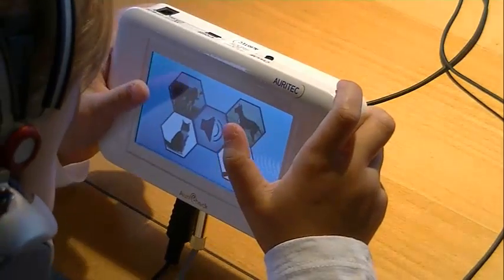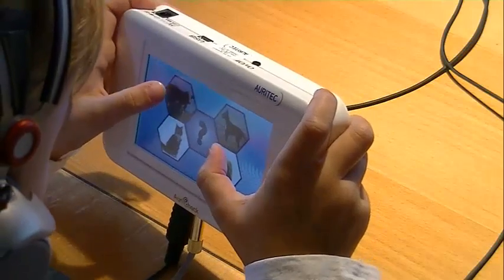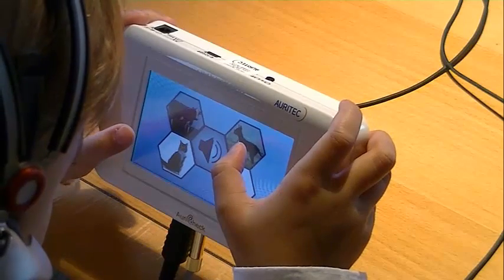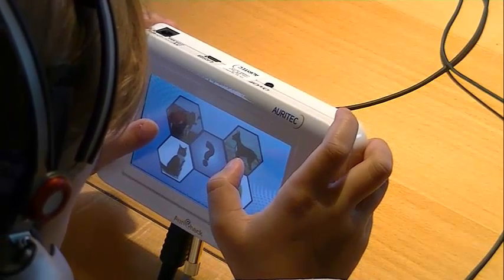After the presentation level for all 4 animal sounds was twice adaptively below the hearing threshold and, therefore, 2 turnaround points of the level have been registered by the device, the test will be terminated automatically.